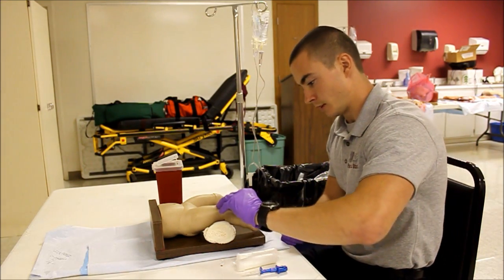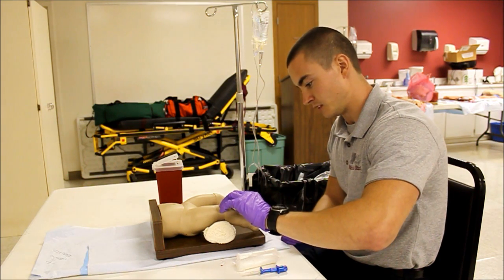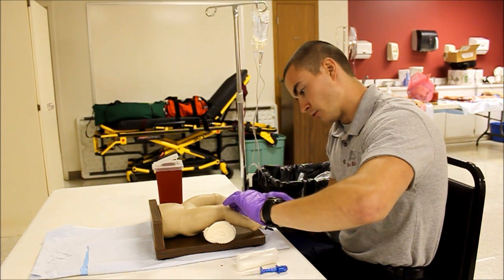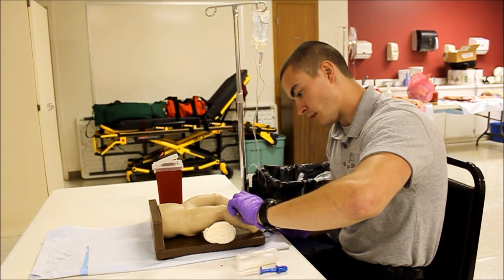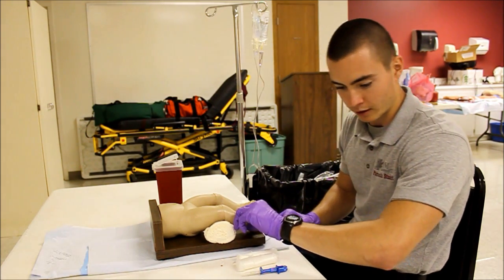I'm going to go ahead and locate the patient's knee. I'm going to find the bony prominence below that, which is the tibial tuberosity. I'm going to go two finger widths below that and find my insertion point, making sure that I'm not going to hit the growth plate.